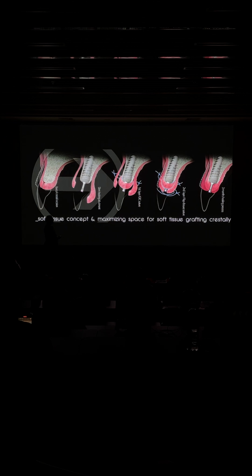So you will need more displacement of your buccal flap to really close it. So that's why the thicker tissue is on the crest, and less and less tissue is placed on the buccal, because usually if you put too much on the buccal, you will see a dissimilarity in the volume you are creating on your implant with respect to the adjacent tooth.